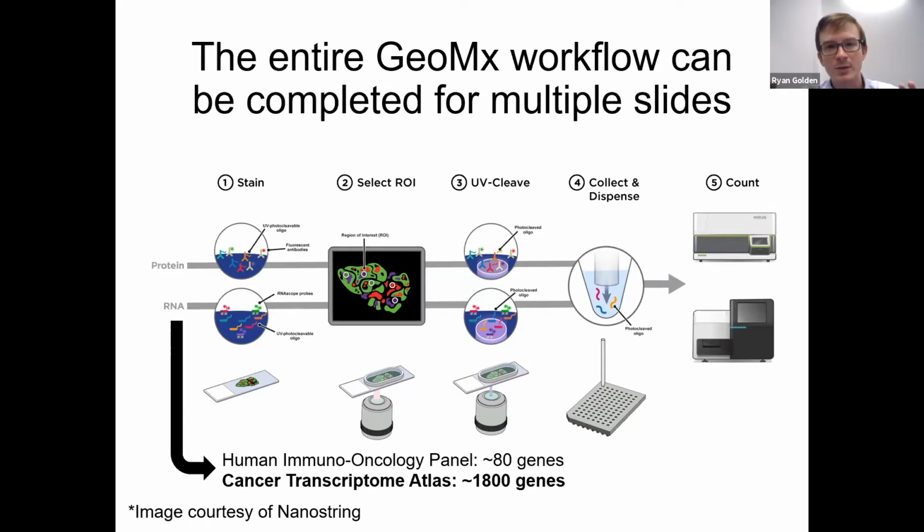And then the instrument captures an image of this fluorescing tissue. And then you can look and say, okay, well, I found an interesting region here where I have CAR-T cells infiltrating into this tertiary lymphoid structure, an interesting region here where the CAR-T cells seem to be attacking the tumor. And so the instrument has software that lets you then draw circles and select what regions you're most interested in. So this is where that level of precision really comes in.